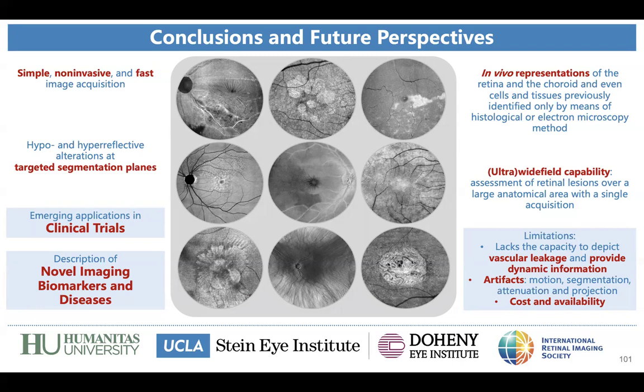And one thing that I think we might make aware for who is watching and want to apply it tomorrow. In OCT, we always think about the application tomorrow, the next day, few days later, and one main point is the segmentation.